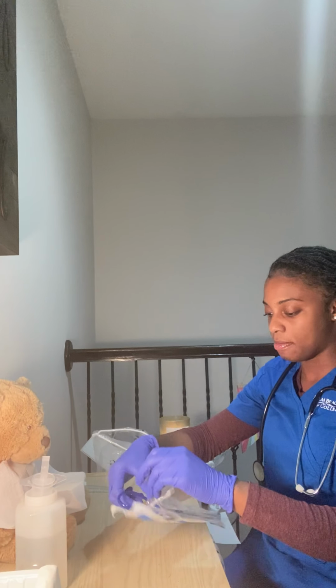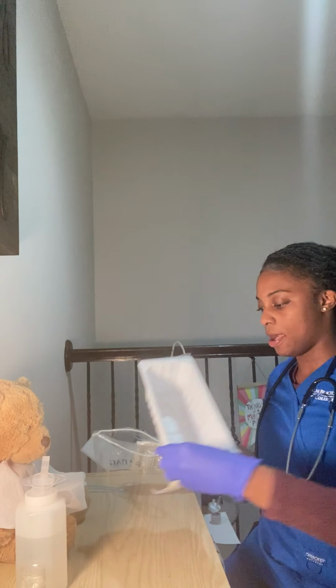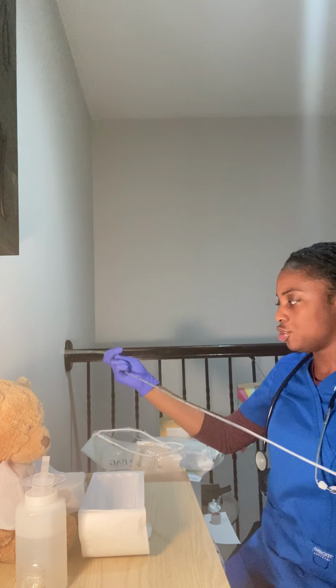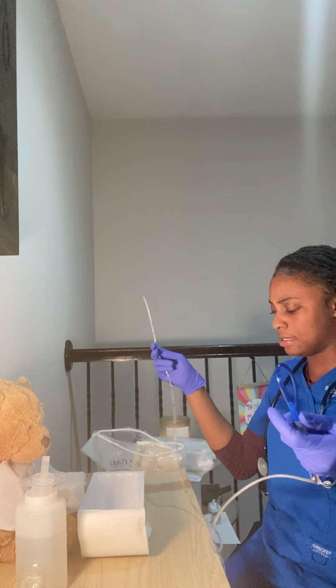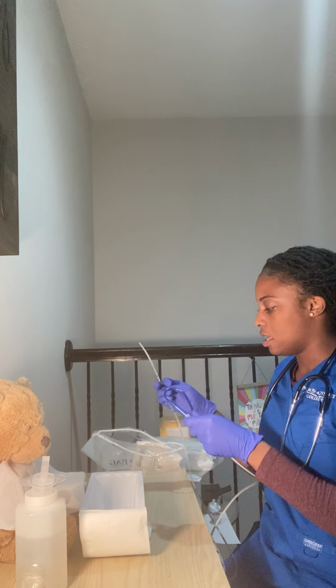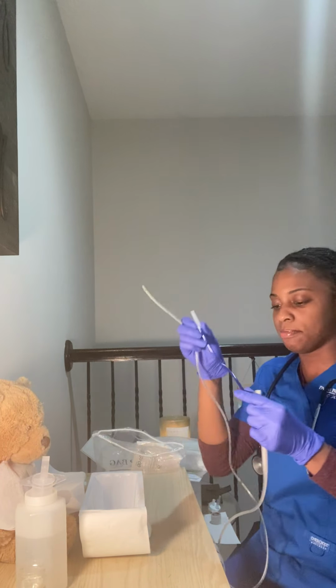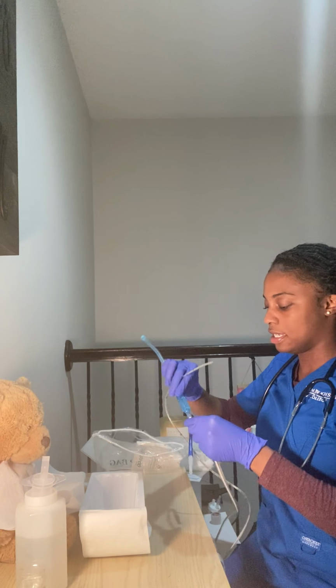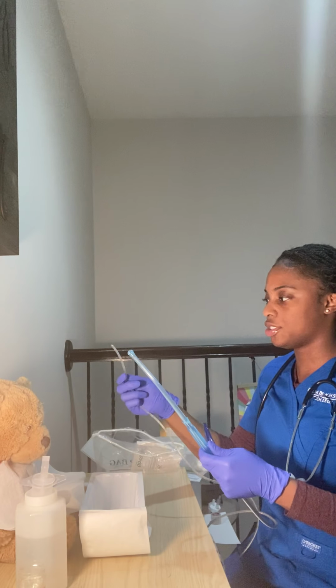I'm gonna go ahead and take my catheter out of my wrapper, and I'm gonna go ahead and get my basin ready for my patient. Before I insert the tube, I'm going to check it to make sure that it's not got any holes or anything in it, and I'm also going to be checking my suctioning. So I'm just going to go ahead, and I'm never using this blue port here. I'm going to go ahead and connect it to my suction and make sure it works.